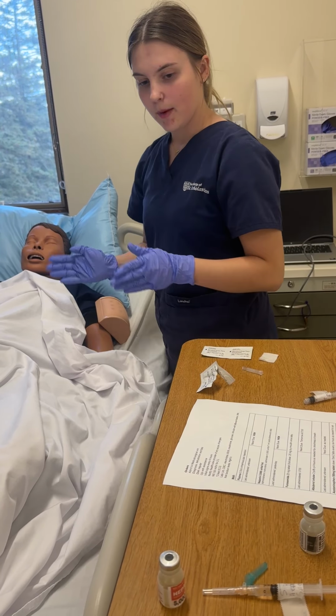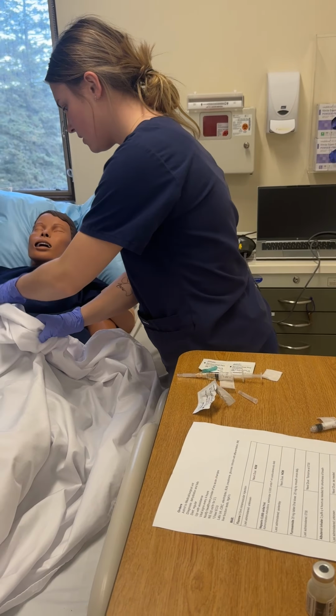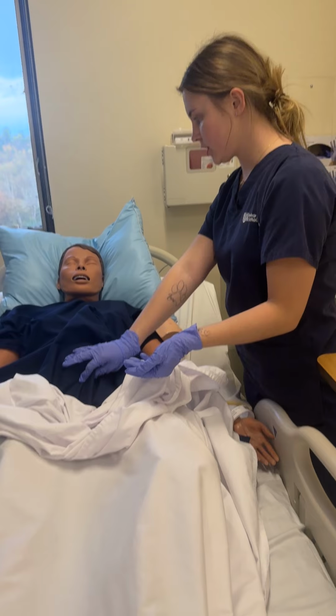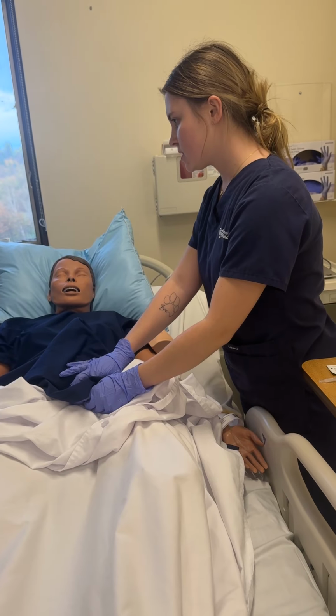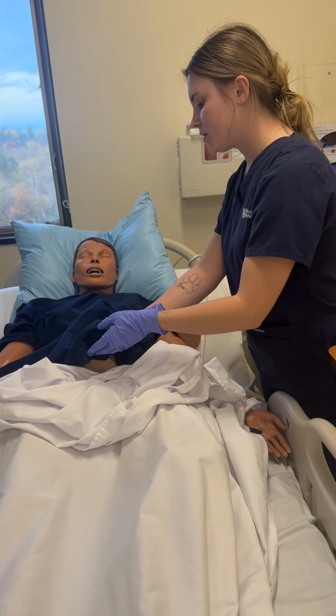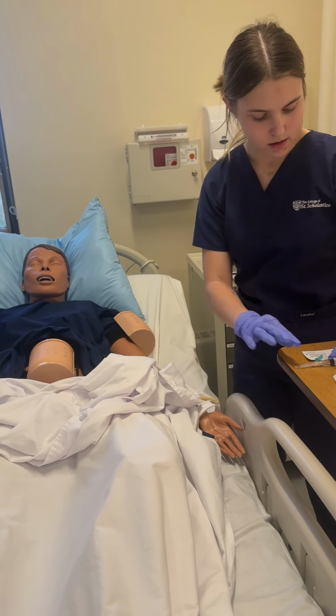Okay, Sam, are you ready for your next injection here? Yep. Okay. So this one's gonna be in the abdomen. It's the heparin. This is to prevent blood clots. You could notice you may bleed easier, you may have a headache, and you may notice some abnormal bruises. Okay.